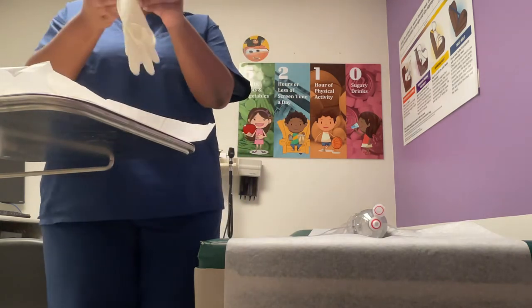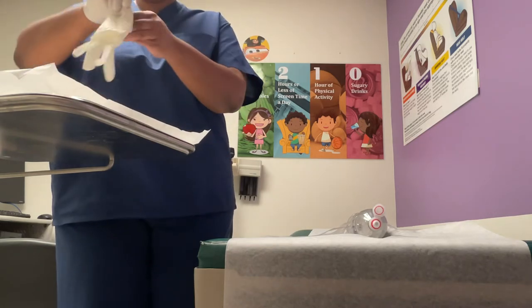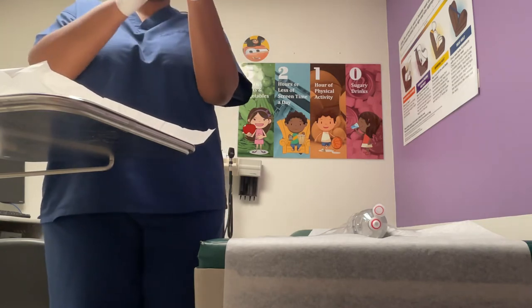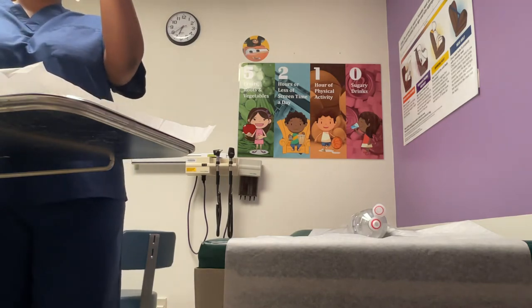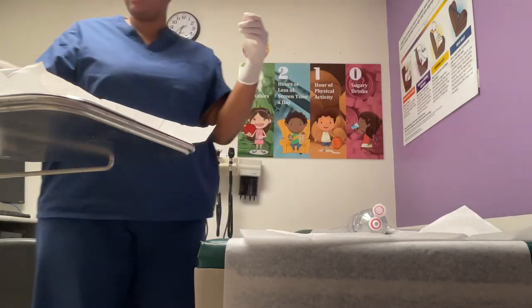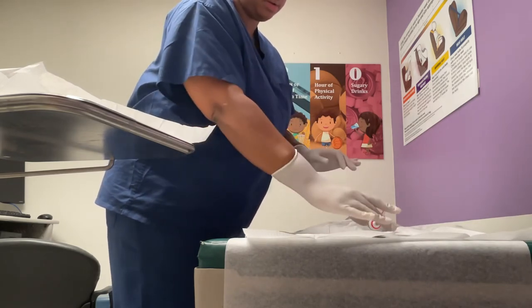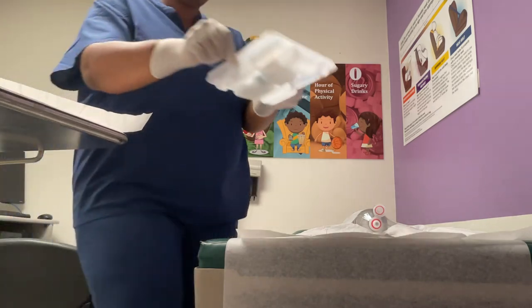I'm going to put on my sterile gloves, starting with the right. I'm going to place this drape under the patient to protect the sterile field. We're going to cover the patient up and bring the sterile drape into position.